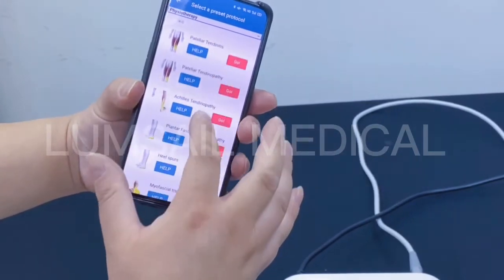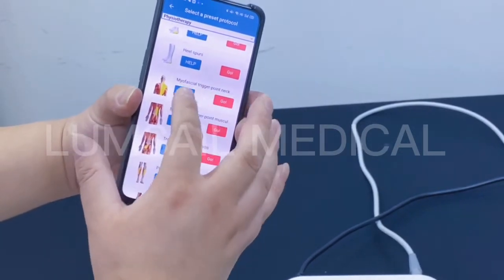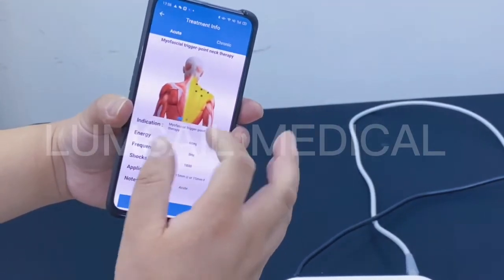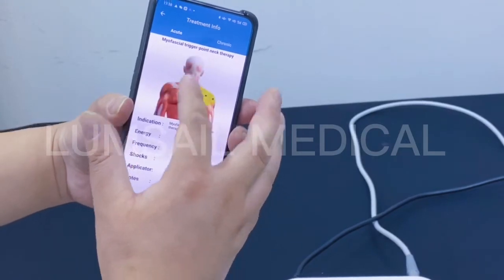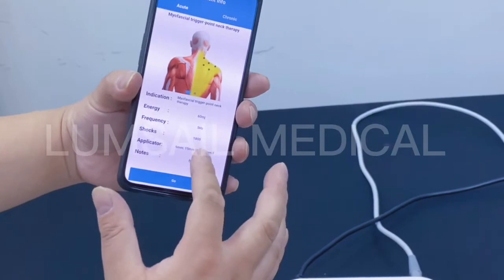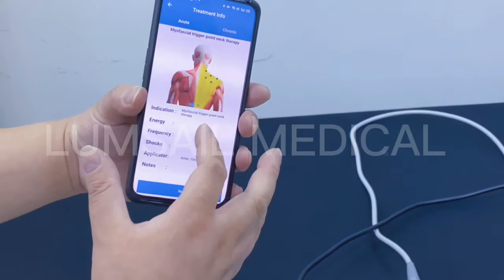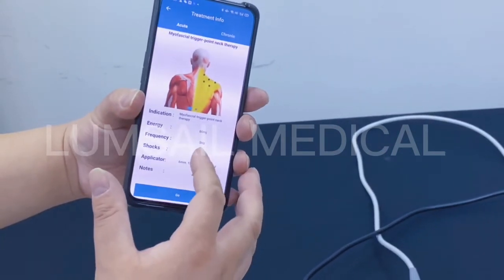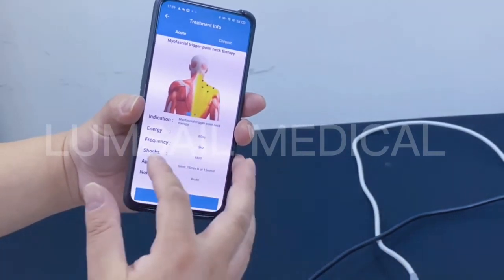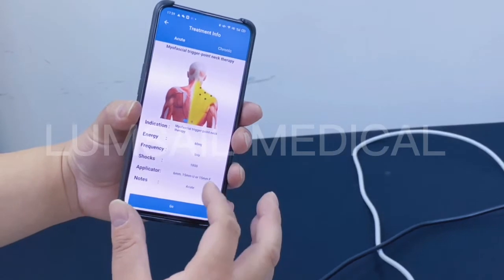We choose the 'myofascial therapy trigger point' protocol. You can see it has acute or chronic treatment types, a photo showing how to perform the treatment and where the trigger points are located on the body. Below there is a detail table with the description of the treatment — how to set the energy and frequency, how many shots will be done in one session, how to select the applicator and handpiece, and a notes field you can modify.